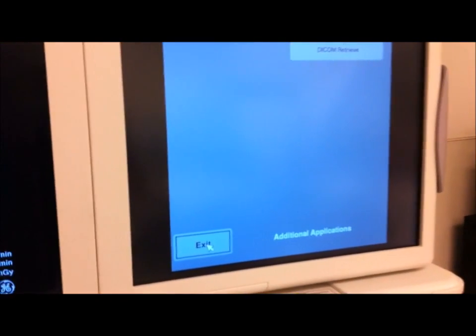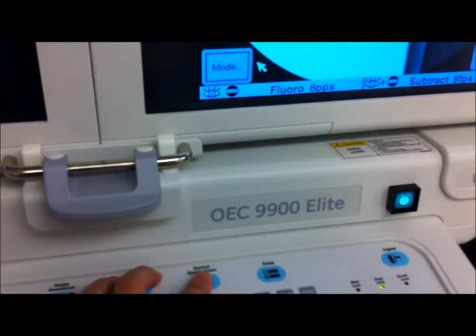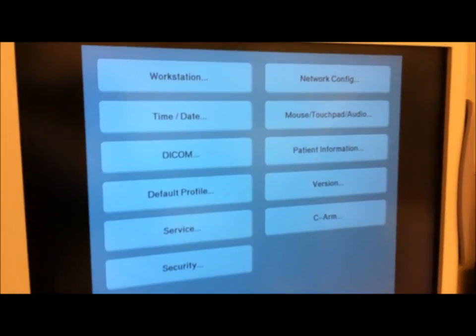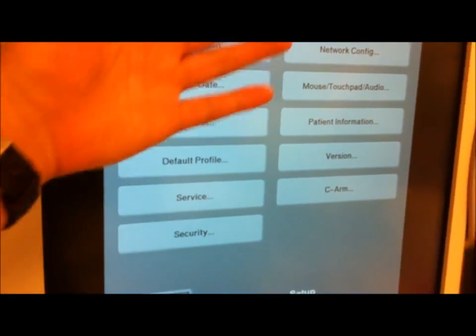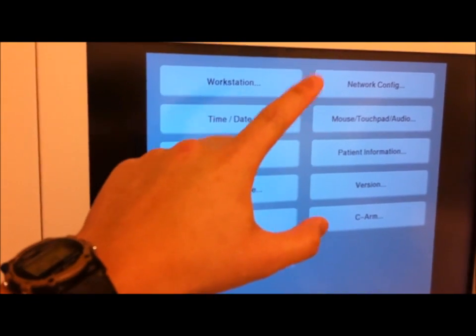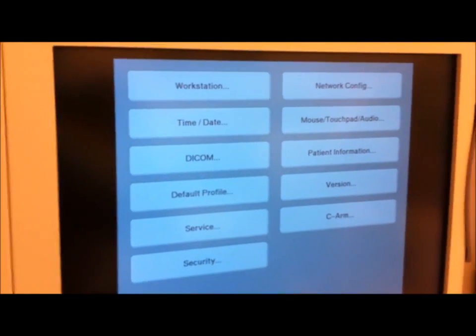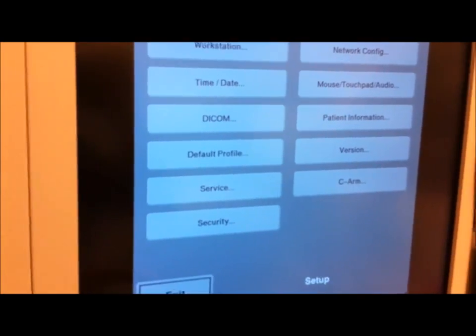The rest of these buttons — well, additional applications — for instance, is DICOM retrieve, which we do not have enabled. You can actually pull images off of DICOM and display it on this right monitor here. Switch applications, same thing — it just beeped at me because I don't have any other applications on. And setup, which is pretty well laid out actually. Avoid trying to play with the settings, especially for DICOM and network configuration, because if your C-arm is attached to PACS in your hospital, this can ruin the settings and the C-arm would not be able to connect. Let's exit.